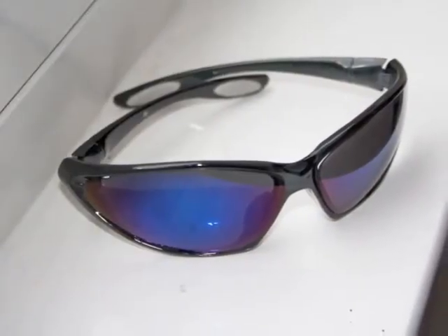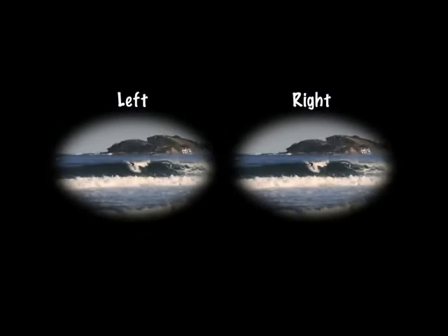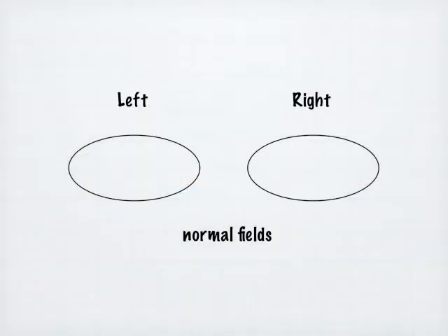The shape of the field of each eye is rather like the shape of a pair of sunglasses. For simplicity, the field of each eye can be documented as an oval shape, with the visual field of the right eye drawn on the right side of the page and the left eye on the left side. This is as if the patient is looking out through the page you have in front of you.